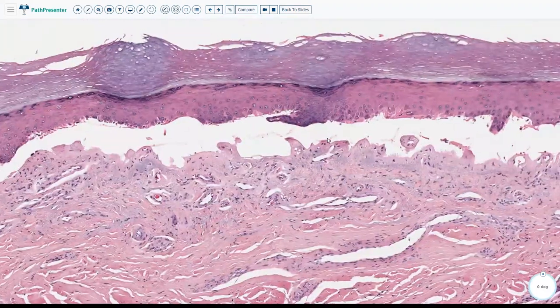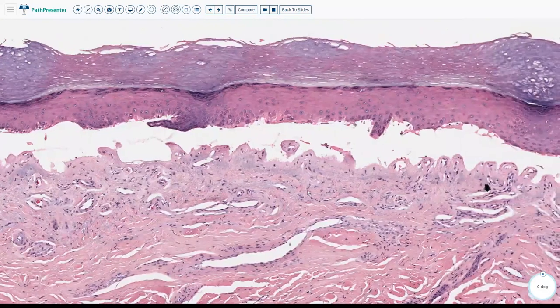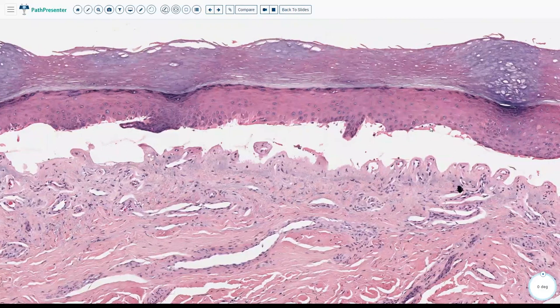A classic feature seen here is called festooning. Festooning is when the dermal papillae retain their outline — they are not collapsed. Normally they should have collapsed, but because the dermis is very sclerotic they do not collapse and retain their outline. Another feature is basement membrane material still stuck to the roof of the blister, known as caterpillar bodies.